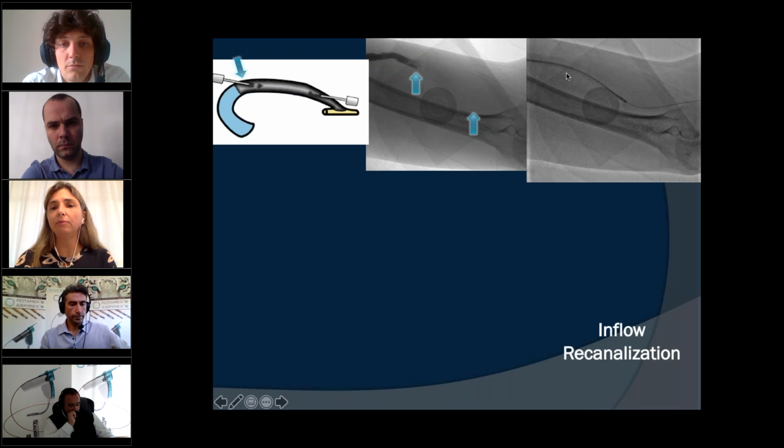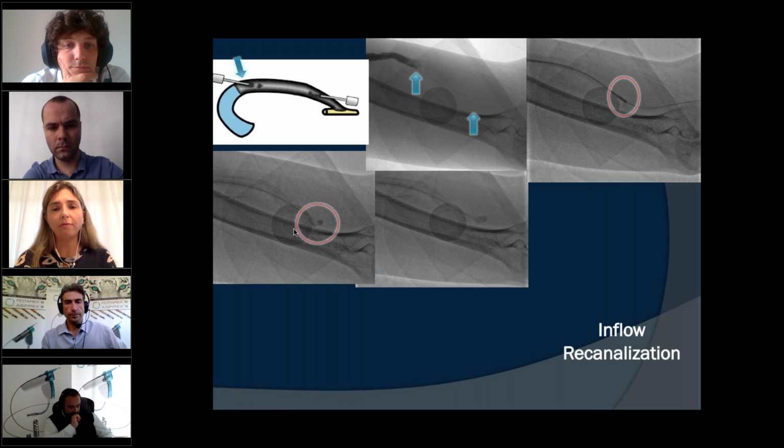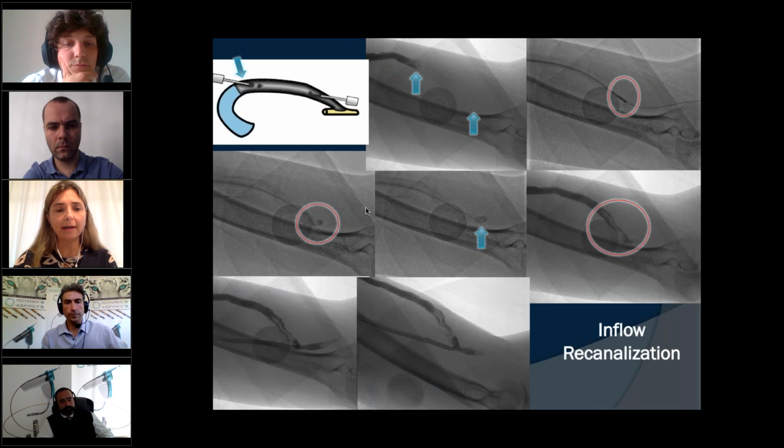Then we proceed with the Rotarex passage over an 018 guide wire. We go as close as possible to the arterial anastomosis, but not through the arterial anastomosis. We reserve a Fogarty catheter, a 4 French or 5 French Fogarty catheter, to pull out the arterial clot, the platelet-rich arterial clot at the arterial anastomosis. And then the final control, there is some lack of contrast filling due to the first puncture.